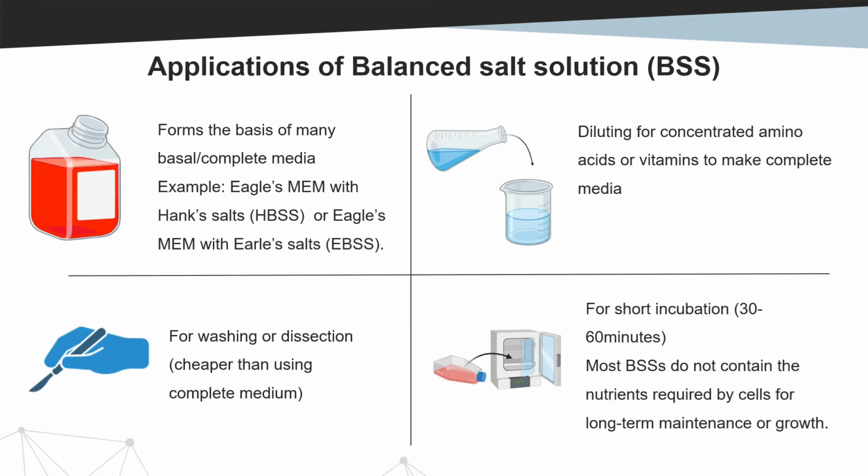There are many applications of balanced salt solution. First, they form the basis of many basal and complete media out there. Second, you can use them to dilute concentrated amino acids or vitamins while you're making the complete media. You can also use it for short incubation of cells, like 30 to 60 minutes.